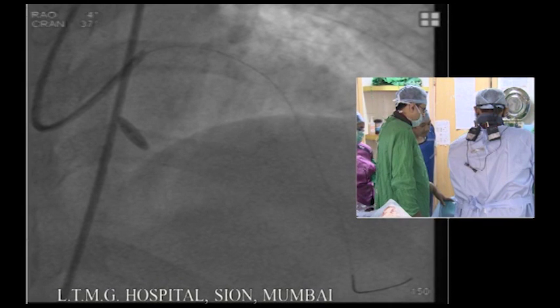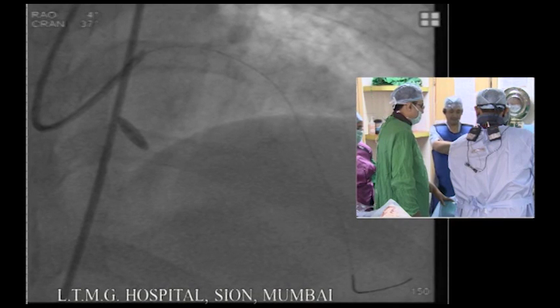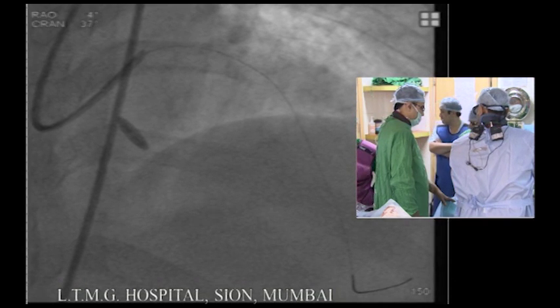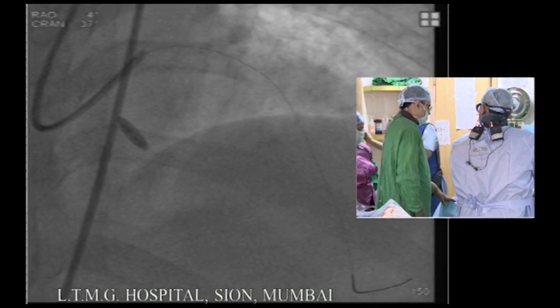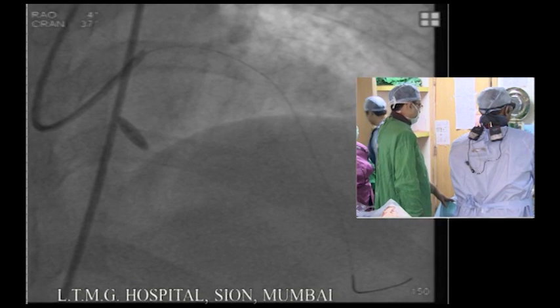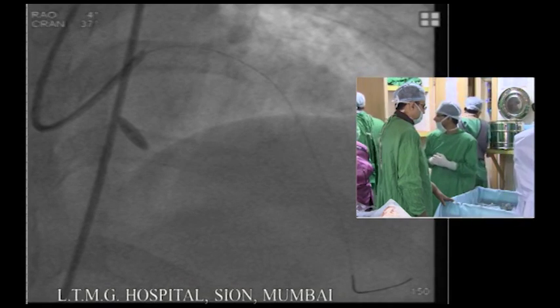In the past, with the current generation, 4th generation drug-eluting stents with thinner stent struts, we might be able to deploy the stent well and also get good apposition. But whereas with the thick struts of the BRS, we have to make sure the vessel is prepared well. We have to do an IVUS first to make sure that the vessel is well expanded before implanting the scaffold.